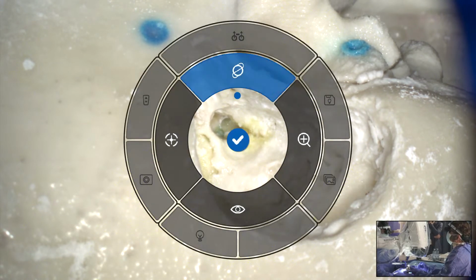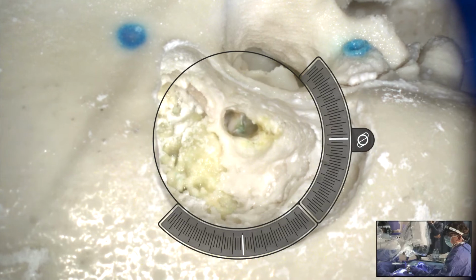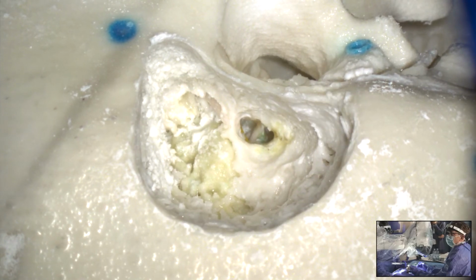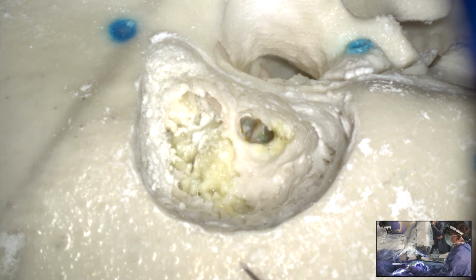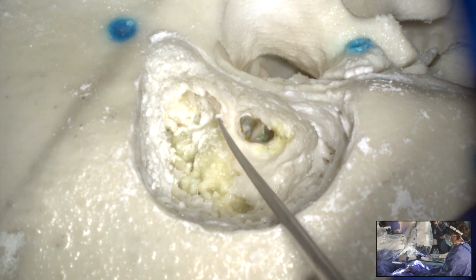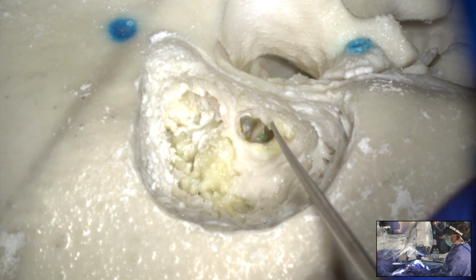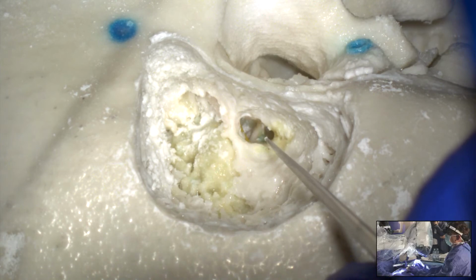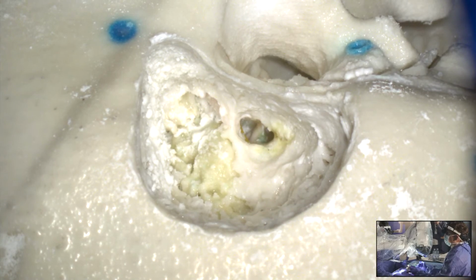Sorry, just the left eye. You have a perfect 3D view, you know, and they just have one eye over here. So thank you very much. Now we turn. We see the skull base here on the left side. And so we see here the incus, and so this is the labyrinth, and then I opened here the middle ear part, and you can see the facial nerve here coming from here to there, and the chorda tympani being up there.